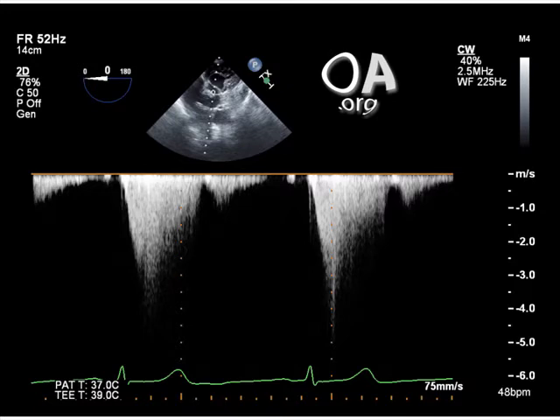This is the continuous wave Doppler profile of the velocity of blood flow at our patient's left ventricular outflow tract. Note the dagger-shaped appearance of flow as compared to the usual rounded envelope that is normally seen in patients without turbulence at the left ventricular outflow tract. The peak velocity here is 3.5 to 4 meters per second. This corresponds to a peak gradient of 49 to 64 millimeters of mercury.